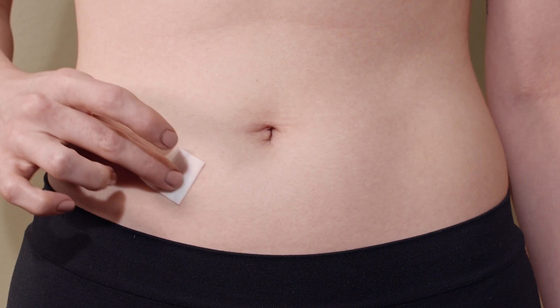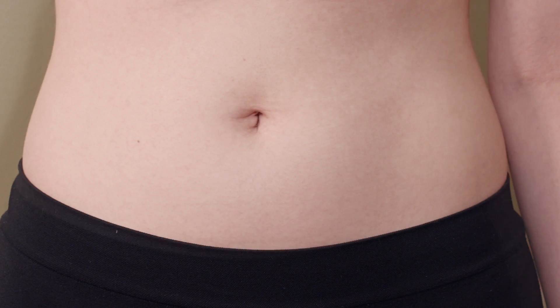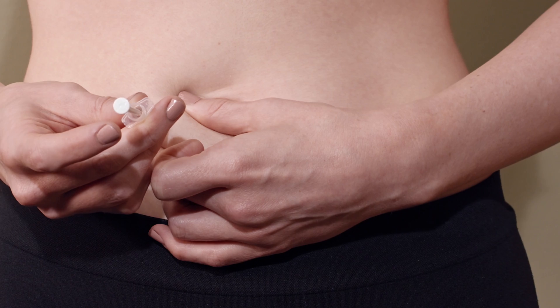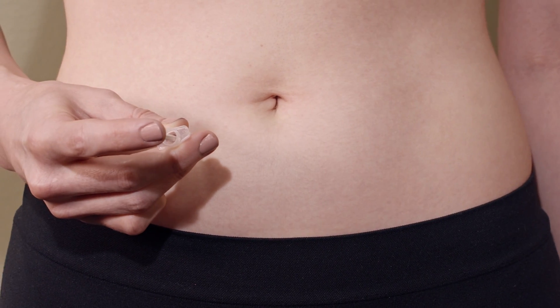Wipe the injection site with an alcohol prep wipe and allow the skin to dry. Take the syringe in your preferred hand. Pinch a folded skin between your fingers and insert the needle at a slight angle. Release the skin after the full length of the needle is inserted.